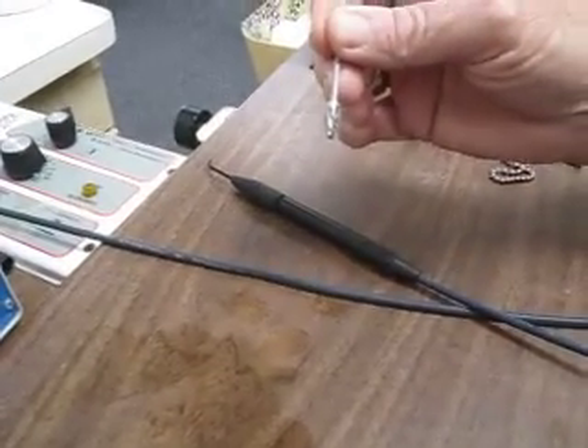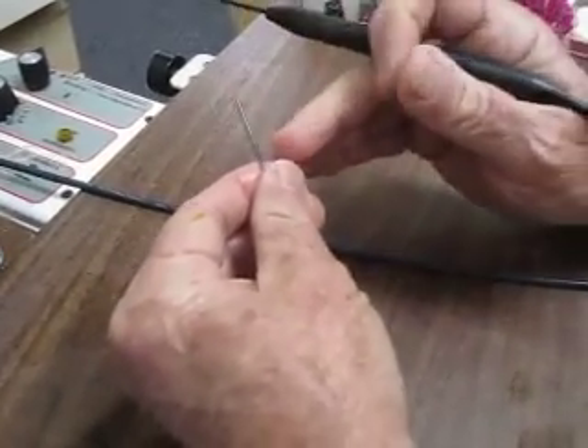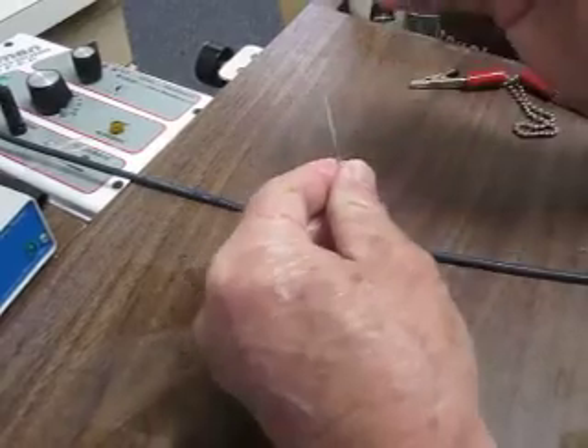We're going to set that burr in some living tissue here, just like this. Now you can imagine that this is an implant in the bone sitting in electrolytes.